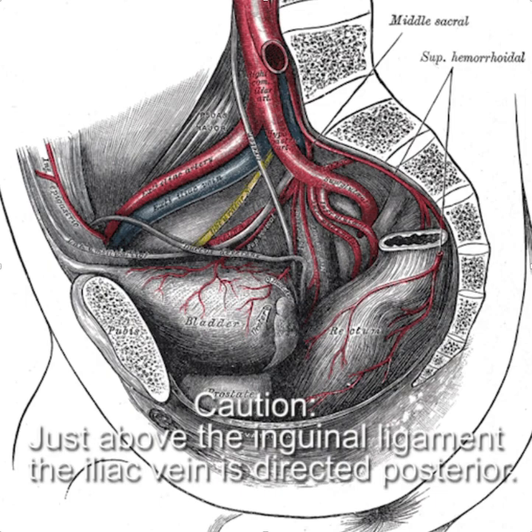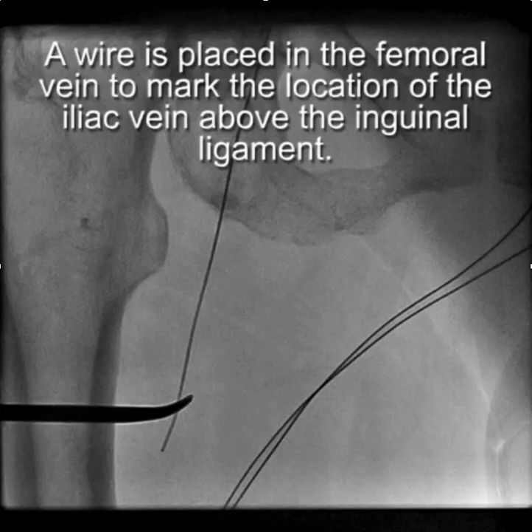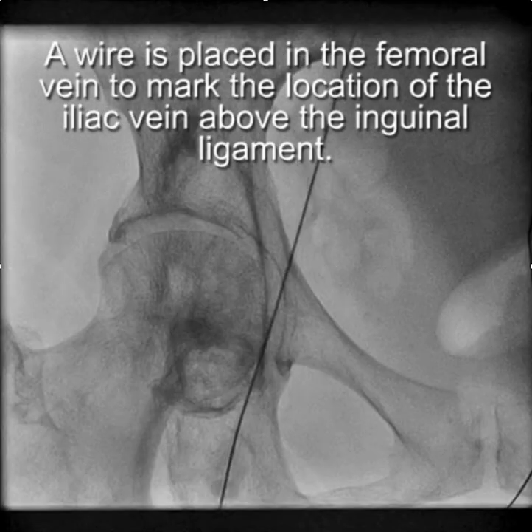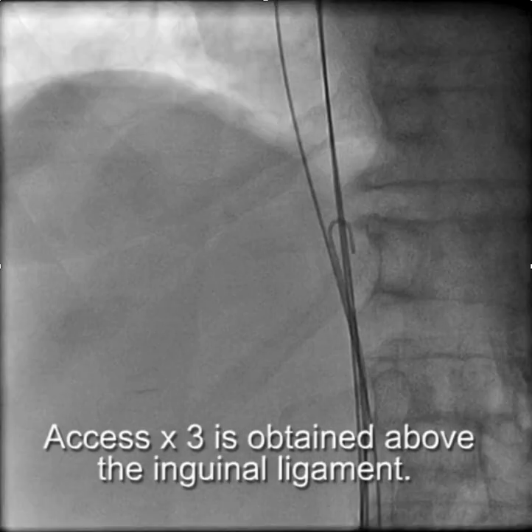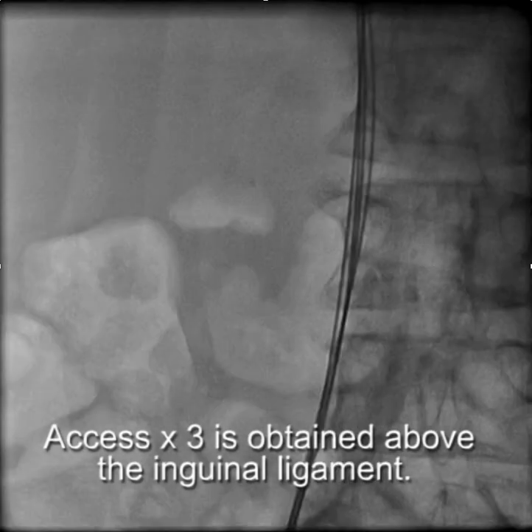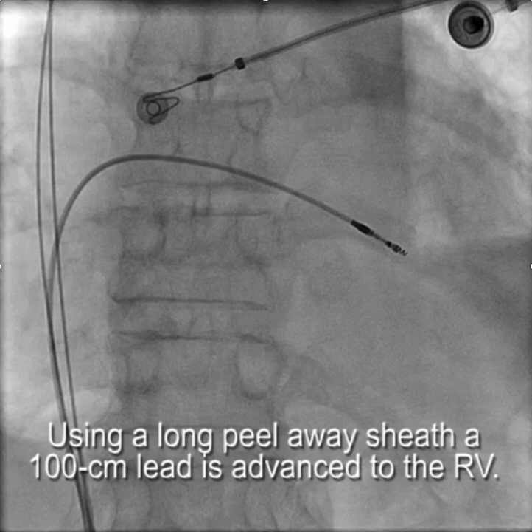It's hard to go very far above the inguinal ligament. So to know where to stick the iliac vein, the first step was to put a wire in the femoral vein and then use that as a target to get access. We got access with three separate sticks and we're using long peel-away sheaths.